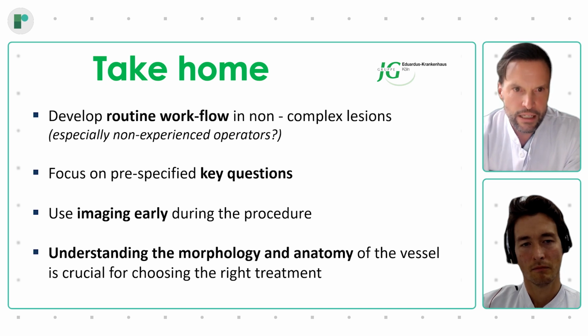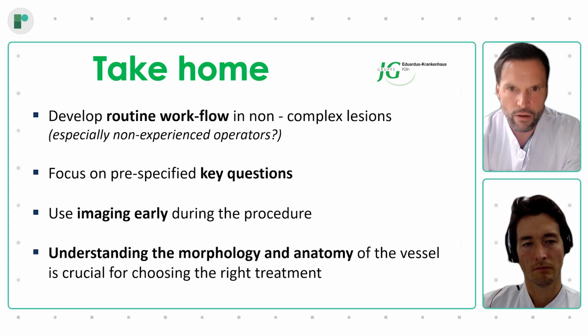It's important in daily clinical routine to develop a routine workflow for, I would say, complex or non-complex lesions, including intravascular imaging and/or the measurement of hemodynamics. And you will see that if you implement this routine workflow, you're speeding up really fast in your daily clinical cases.